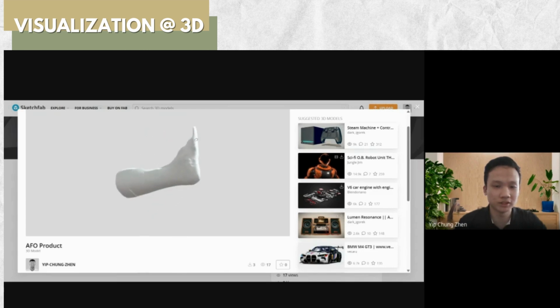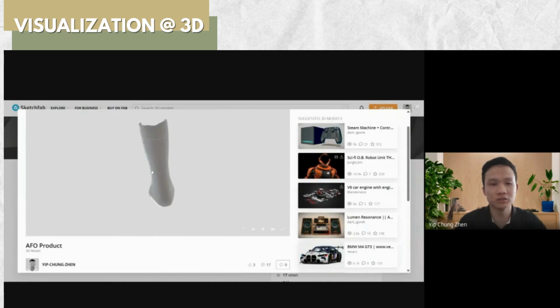So basically it's like this: behind, front, down here, and then in front, and the side also. Okay, so that's all for our 3D model, and for more information you can click on the link in our report to see more details here.